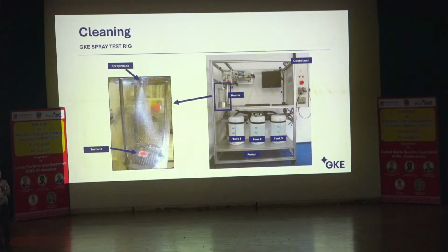In your machine you also have nozzles, and you spray on contamination, but it only sprays when the spray arm is passing by. So it sprays, it stops, it sprays, it stops. And it may even be reflected by other objects. It is not hit directly. Here we can provide a spray situation which is completely controlled. So we know very well what we will spray on this test soil.